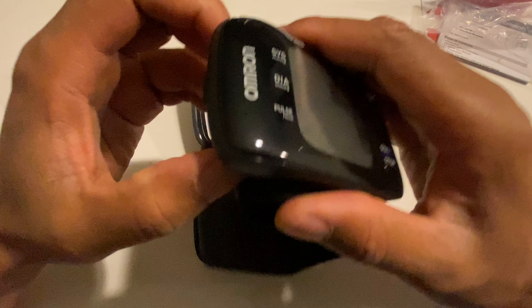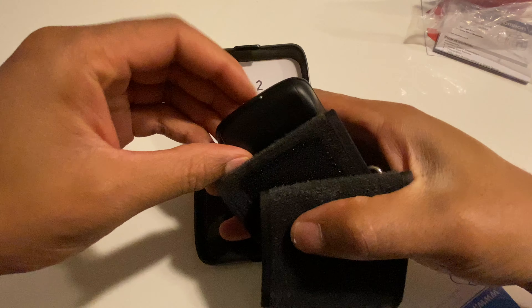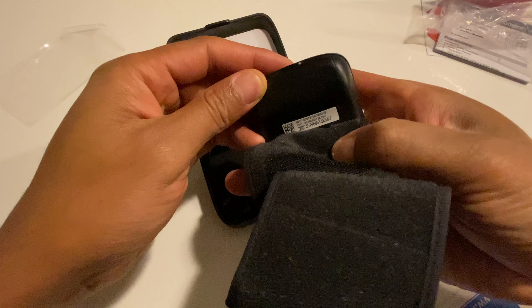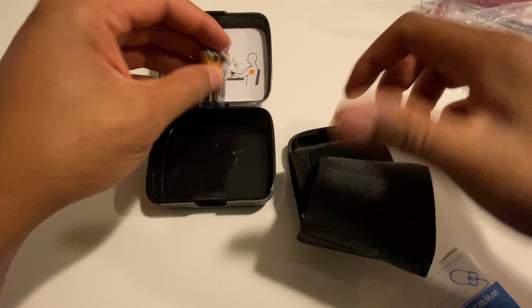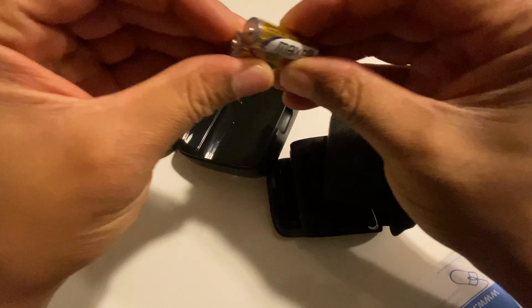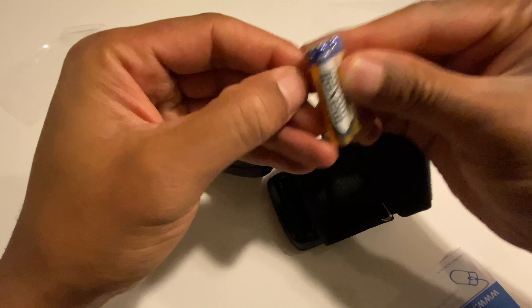Today I'm going to show you how to insert the batteries inside an Omron blood pressure monitor. I flip the monitor cuff on the backside and there is a slot right here for the clip. I remove it just like that, and then I'm going to take the two AAA batteries that come with the blood pressure monitor.